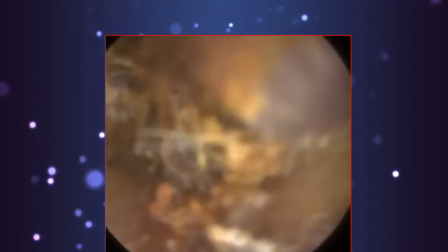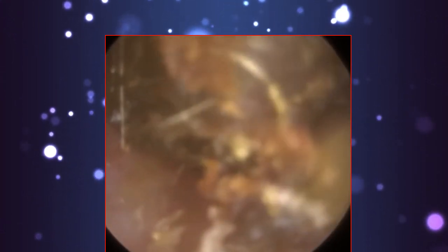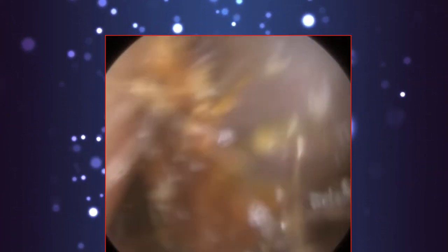You can almost explain it and compare it to wet sand in a bucket. If you're on the beach, you fill up your bucket with wet sand and then you use the back of the spade to hammer it in, and it just really impacts it, makes it really, really difficult to remove. So just put some drops a bit quicker, a bit sooner, and you can see the suction probe just about fits in the ear, so it's really narrow.